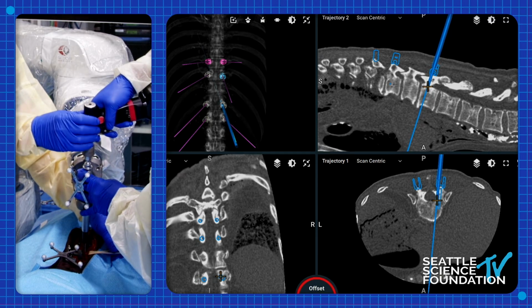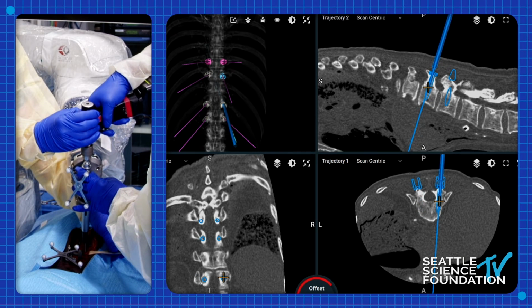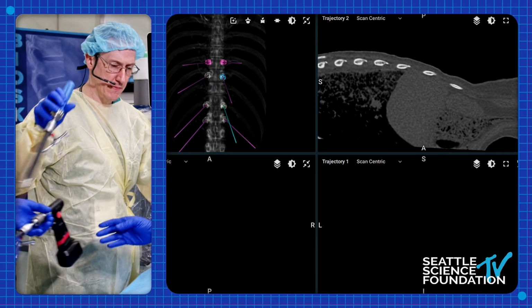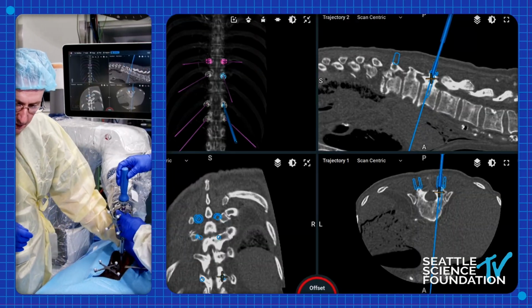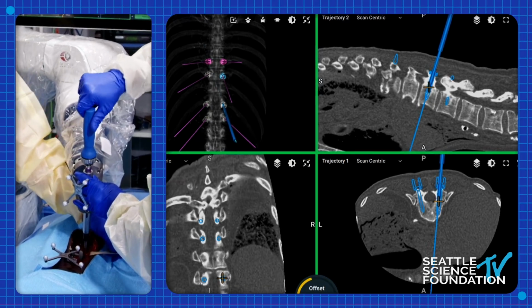Do you find, so it looks like we're in the green zone, do you find yourself in the osteoporotic population hand placing the screws so you have that tactile feedback of what the bone feels like, or you just still use the drill? I'm sorry, I missed the first half of the question. For the osteoporotic population, do you hand place the screws, or do you use the power?